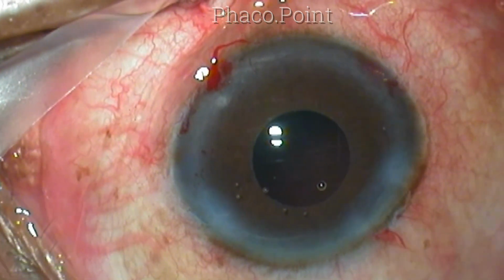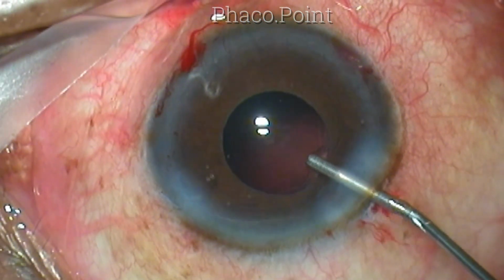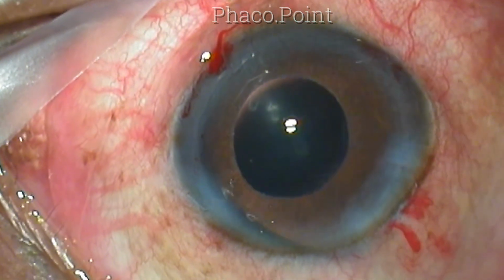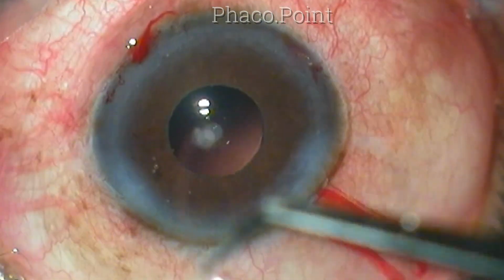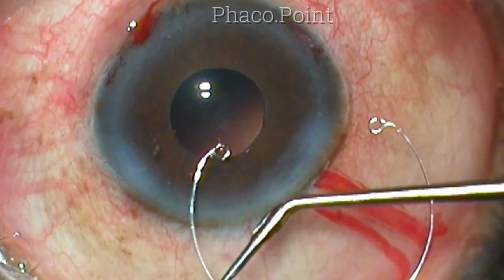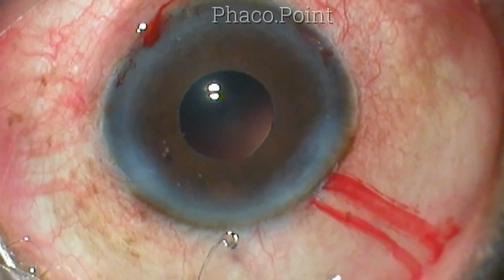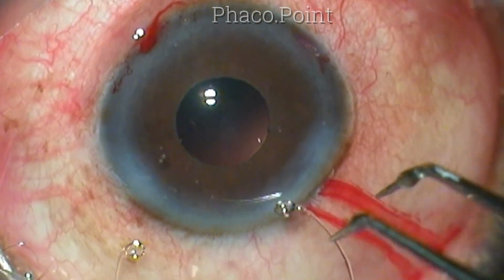Now I've got all the cortex out, and because I suspect that I could have created an inferior zonular dialysis, I decide to go ahead and implant the capsule tension ring, 10.5 millimeter ring. This ring is made of PMMA, and it helps to create an equatorial stretch of the capsular bag and helps to support the bag. So I use two plain forceps in order to implant the capsule tension ring.